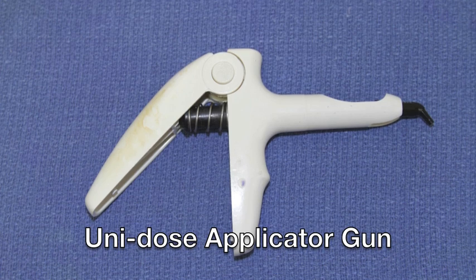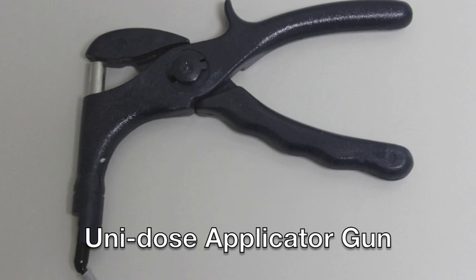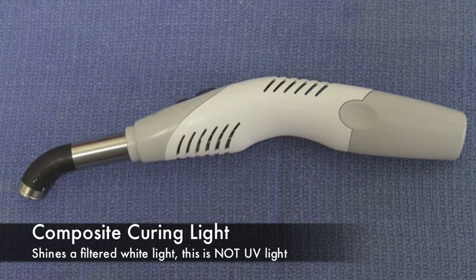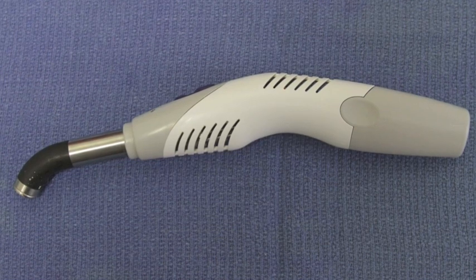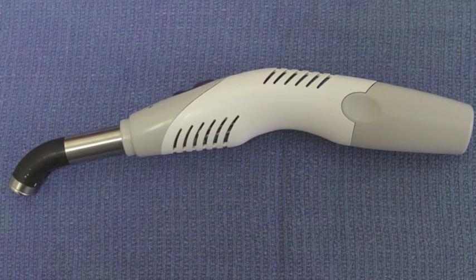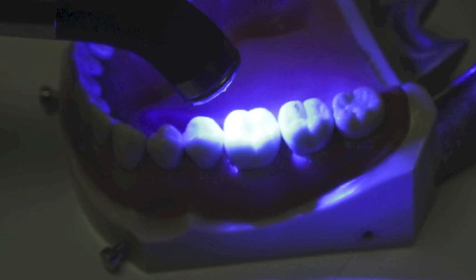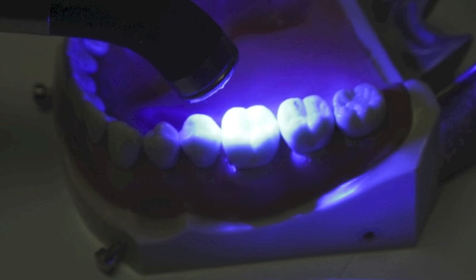Illustrated here are two examples of dispensing guns for the capsules. The curing light is a device that emits filtered light of a specific light spectrum. This light energy initiates the polymerization process, causing the bonding agent, the flowable composite, and the universal restorative material to become hard or set. The time that the curing light shines on the tooth is dependent on the formulation set by the company and is somewhere between 20 and 40 seconds.